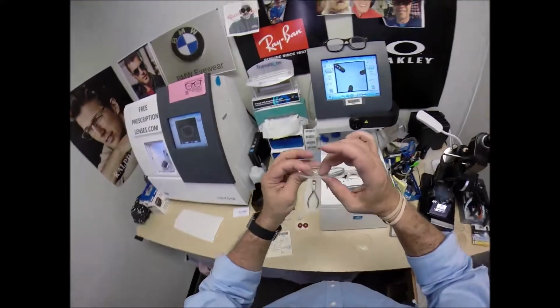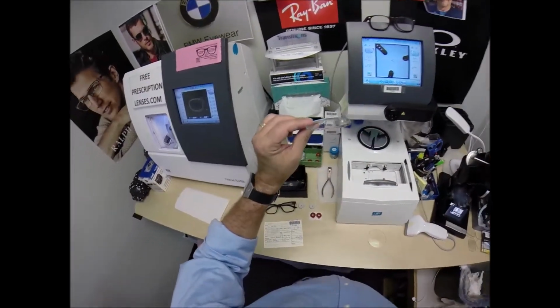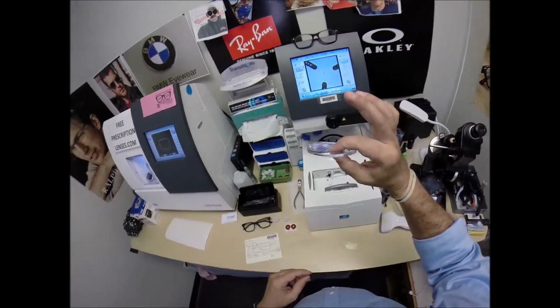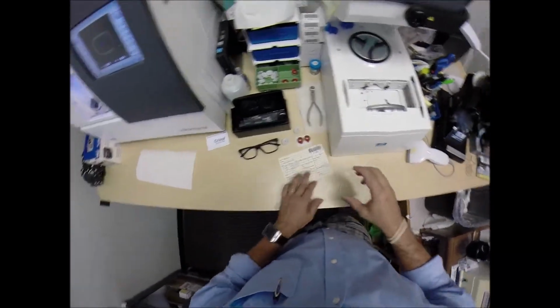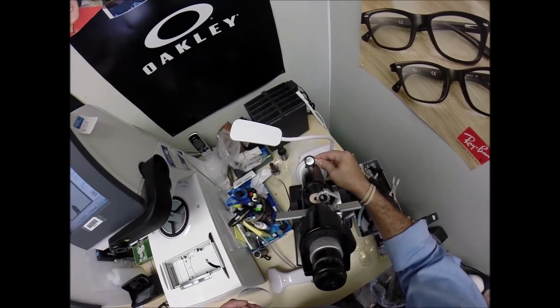But the nice thing is I went ahead and got them as thin as I could. I got them at 1.0 millimeter center thickness instead of the standard 1.5 millimeter thickness. But that's the nice thing. When I do custom, I can have them specify exactly how I want it done.